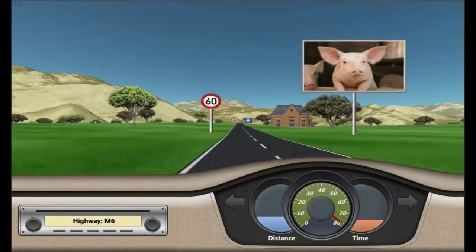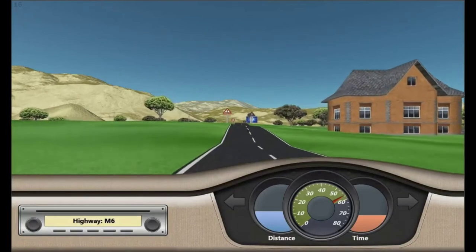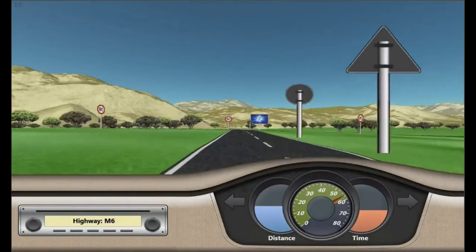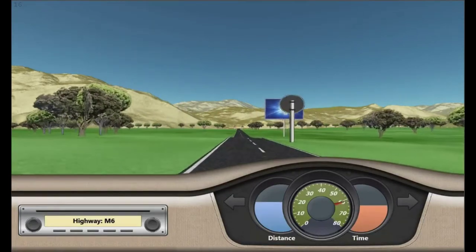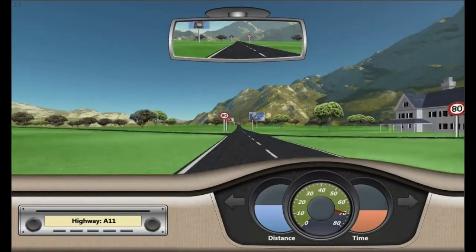On the M5 to the west of Birmingham in both directions between Junction 3 at Halesowen and Junction 4 at Bromsgrove. As difficulty increases, the duration and frequency of stimuli will become shorter and faster. For high-performance patients, an additional visual stimulus can be switched on in the form of a rear-view mirror. RehaCom works auto-adaptively.